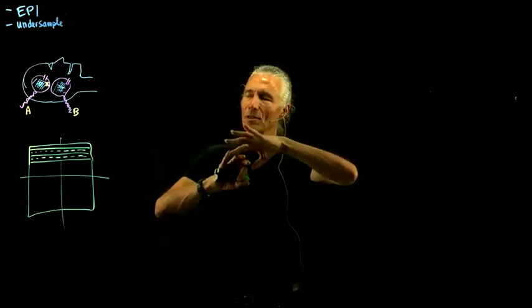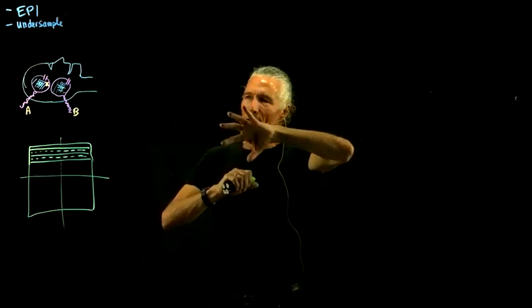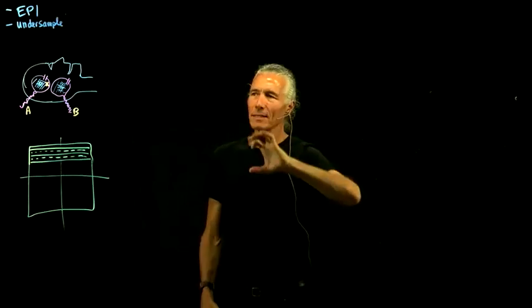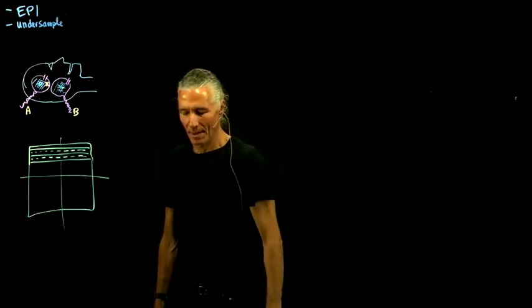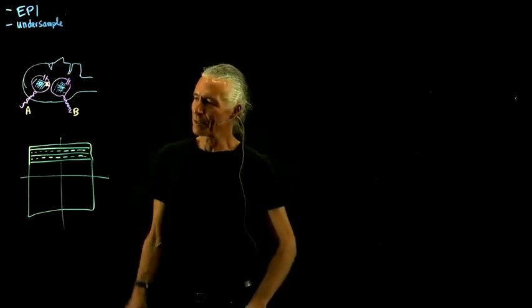You'll get these ghosts that move down by half of the field of view. So it looks like you got another copy of the brain that's displaced on top of your actual copy by half of the field of view. Obviously that's not going to work. You just can't leave it out.